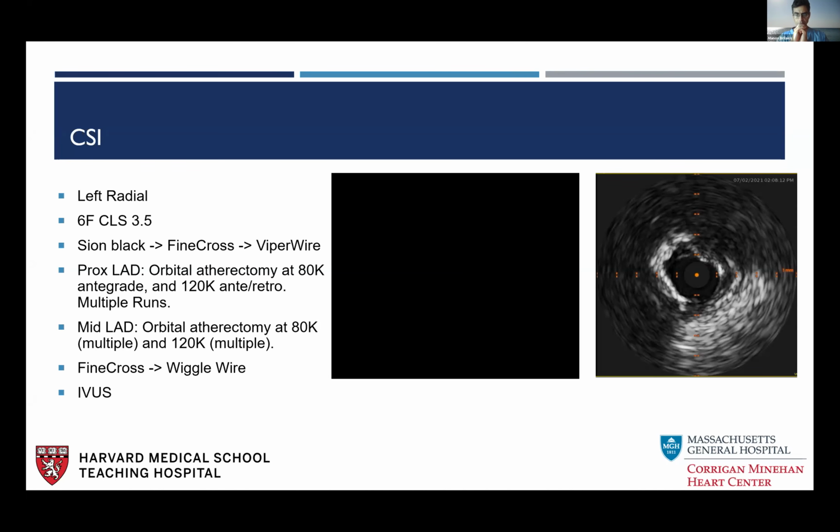I think I agree with doing it, given the decompensated heart failure and the presentation. Looking at the IVUS and the angiogram, I think some school of thought would be to maybe try an AngioSculpt first, but definitely with this amount of calcium, upfront atherectomy would also be reasonable.